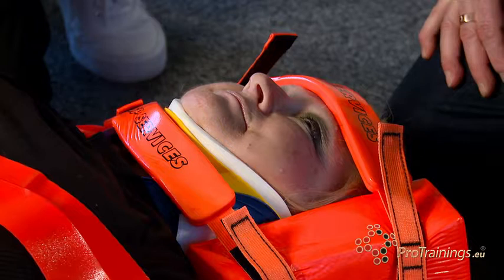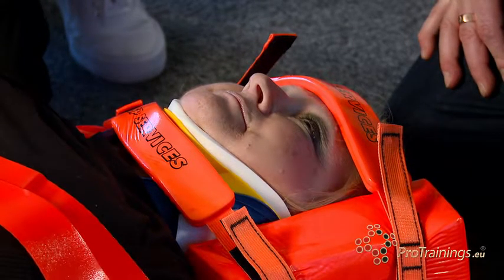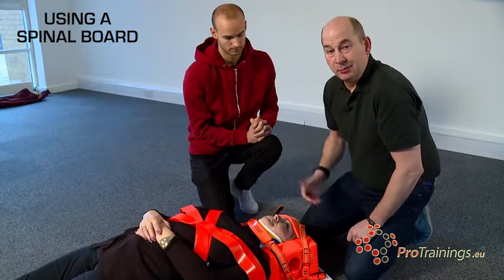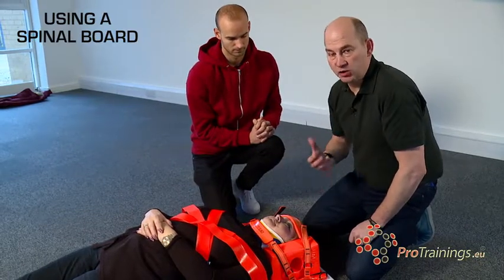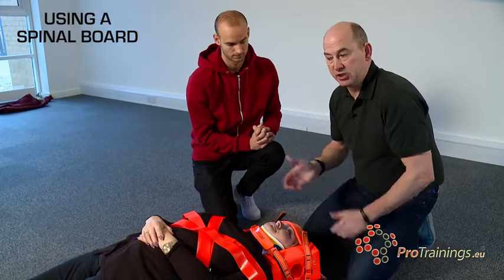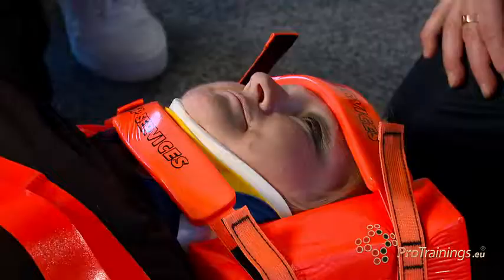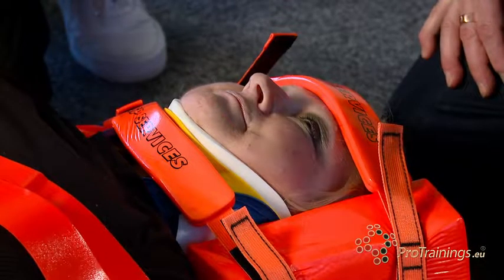If this patient vomits or has any airway problems, we must be prepared to roll the patient or use suction, because the airway is now totally in our hands. If they vomit, they can't move their head to clear their airway, so we have to do that for them — which means postural drainage on the board or using suction very quickly.